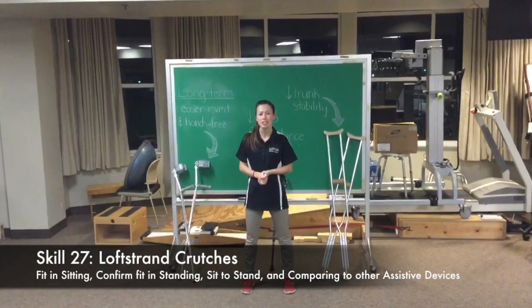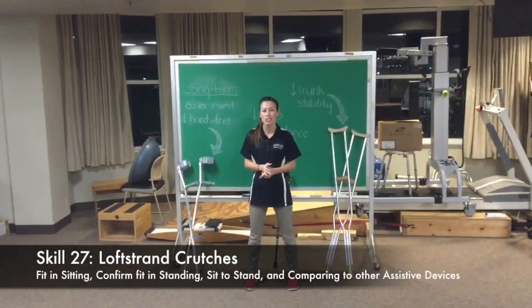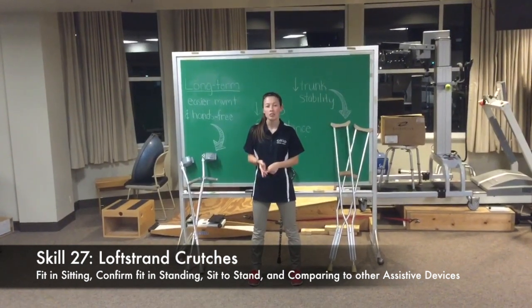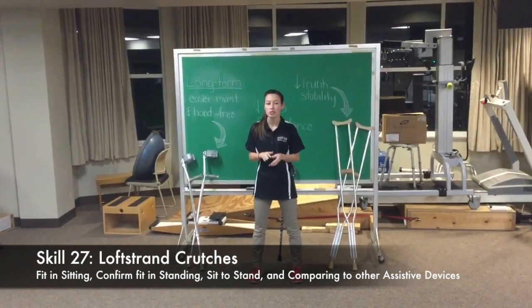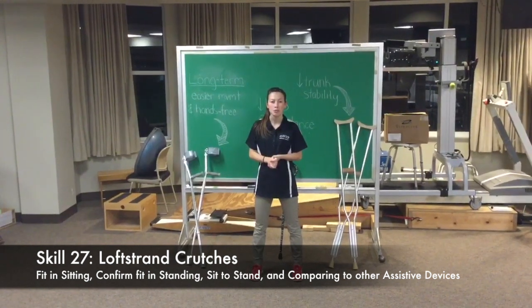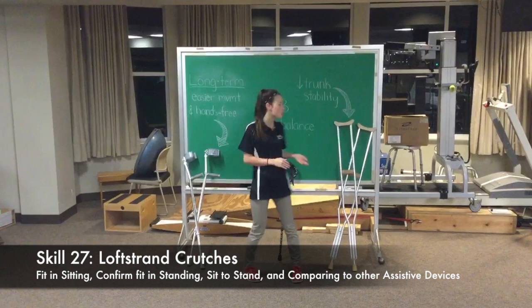Hi, I'm Taryn. Today I'm going to be teaching you how to fit lofstrand crutches in sitting, how to confirm the fit in standing, how to get your patient from sitting to standing using the lofstrand crutches, and also I'm going to be comparing them to the usage of axillary crutches and canes.